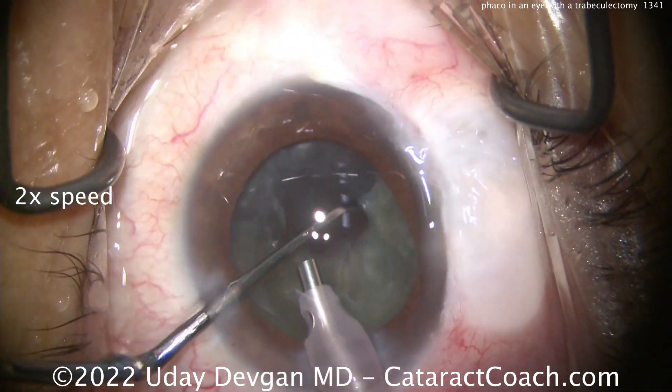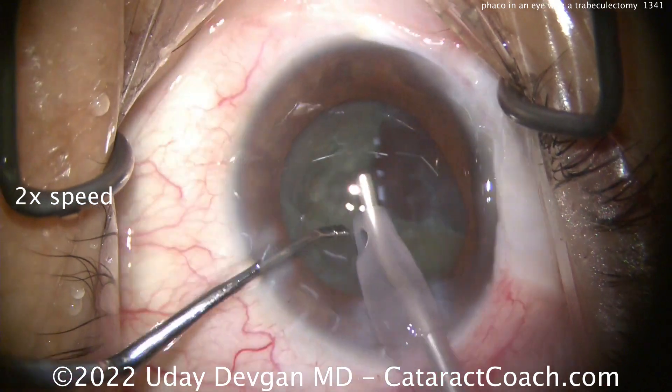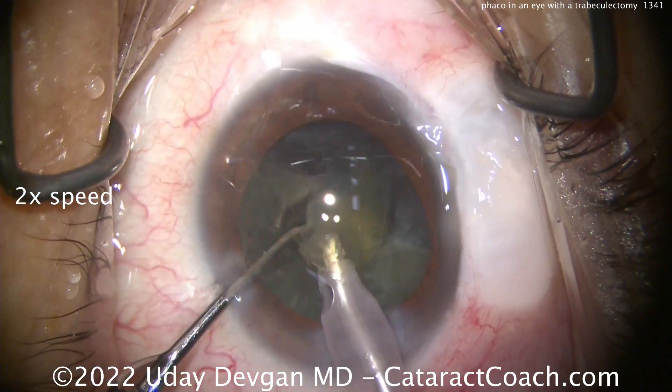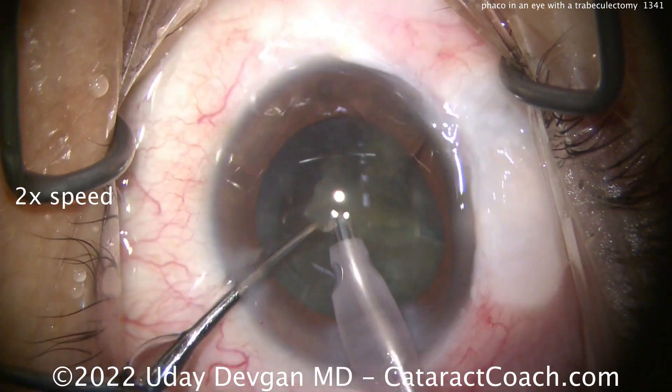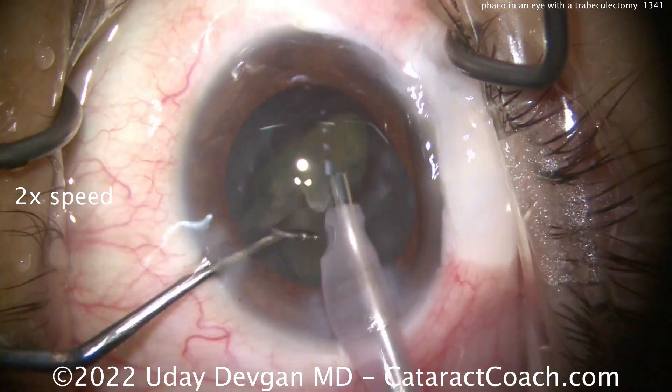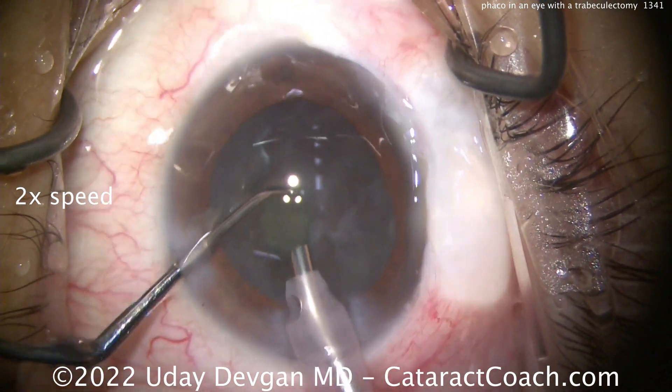I'm also watching that bleb during the case. I did put a little bit of a viscoelastic plug in that area — when we put in our dispersive viscoelastic at the beginning of the case, I put a little extra viscoelastic there. Not too much, and I don't want to leave that in the eye. But during the case, I want to have stable fluidics.